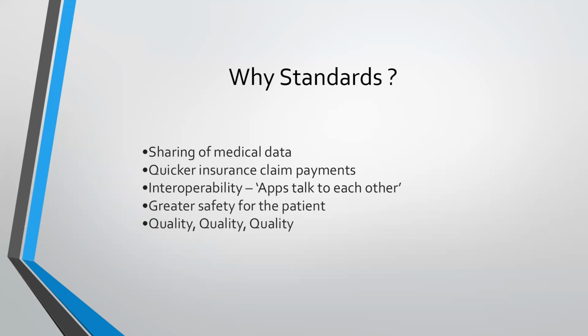All of this is eliminated with the standard, right? The standard will tell you this is the structure that you have to follow, this is the messaging format, and this is what you have to do with each and every data element that you are about to transact.